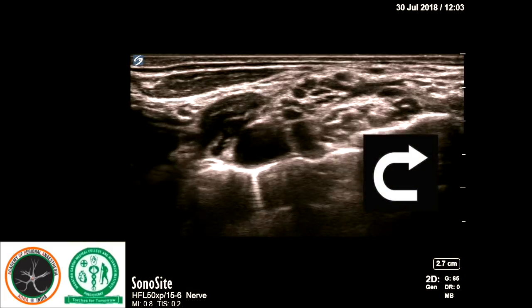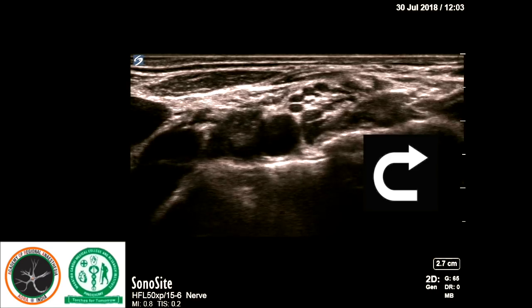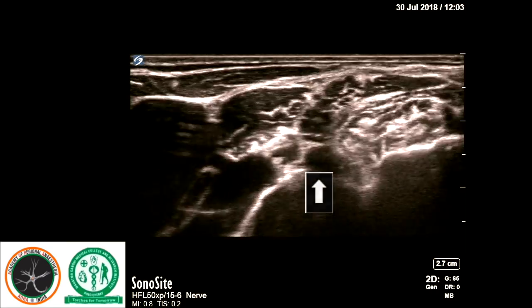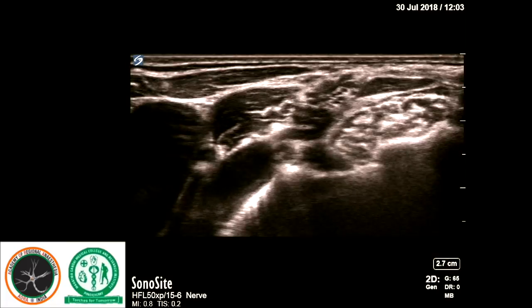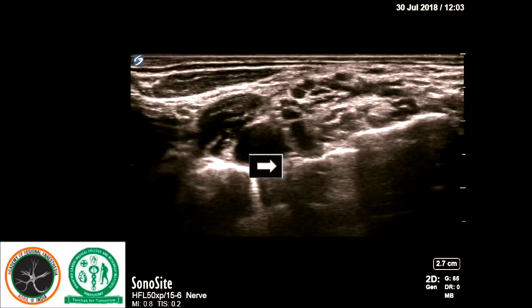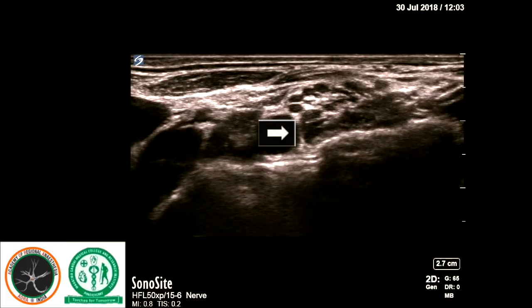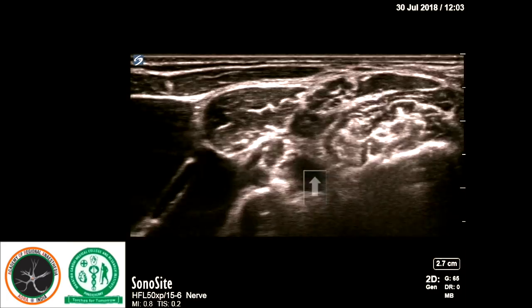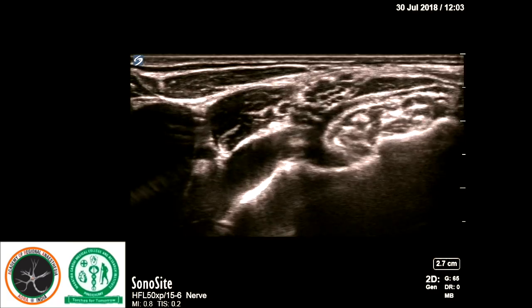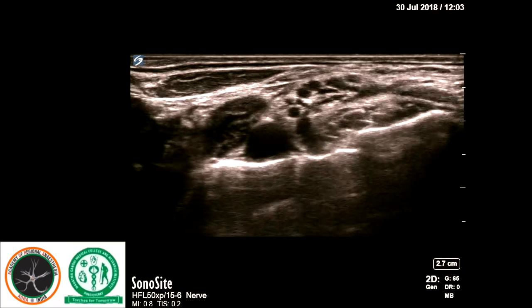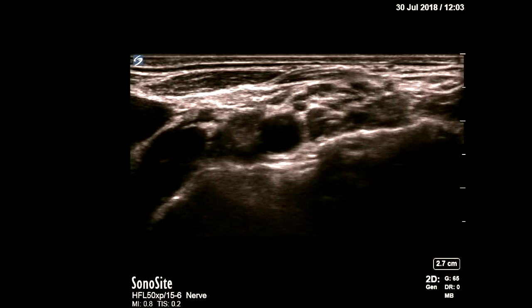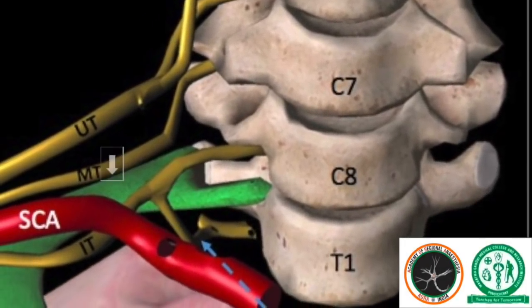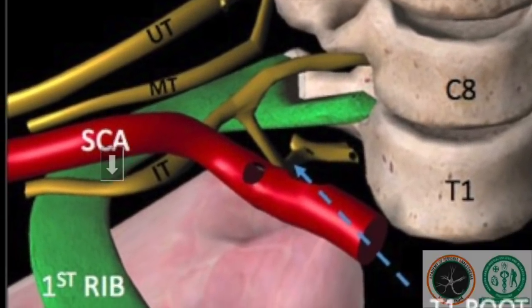T1 is a little more complicated, where it appears as if the T1 root is taking a U-turn. Hence, we've assigned this as the U-turn sign, as the root appears to take a U-turn around the rib from below to above. This, however, we need to remember is a paradox, because even though we describe it as a U-turn, it must be remembered that the same root arises posteriorly below the rib and then travels antero-laterally up on top of it.